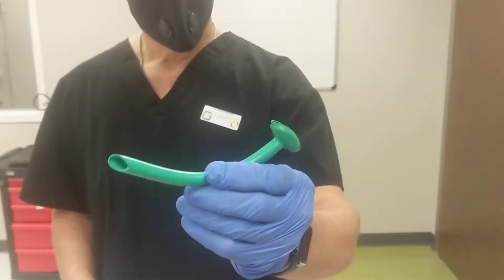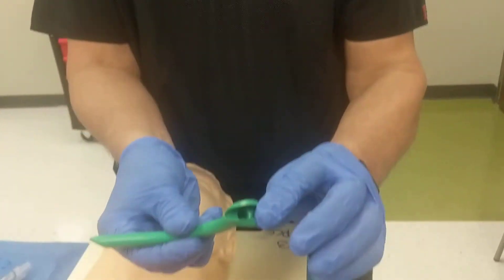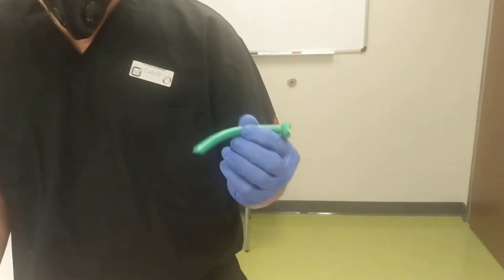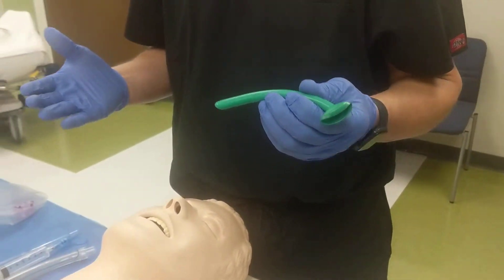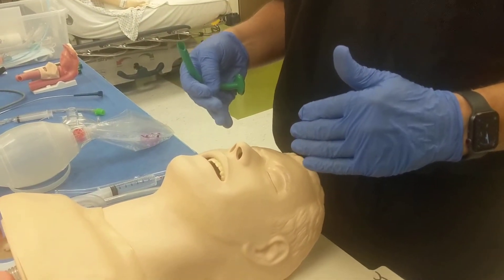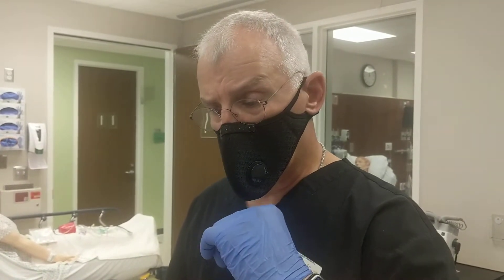This is a standard nasopharyngeal airway. It's made out of rubber, it has an angulated end and a trumpet at the proximal most end. These come in different sizes, so the first thing we have to do is make sure we have the appropriate size for the patient. We have a patient who, while in the supine position being resuscitated, has sonorous breathing, indicating that the soft tissues of his tongue have fallen against his posterior oral pharynx and obstructed his airway.